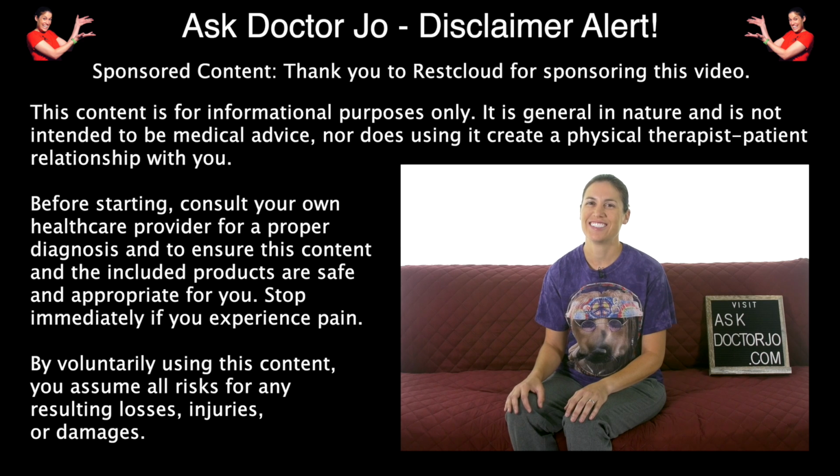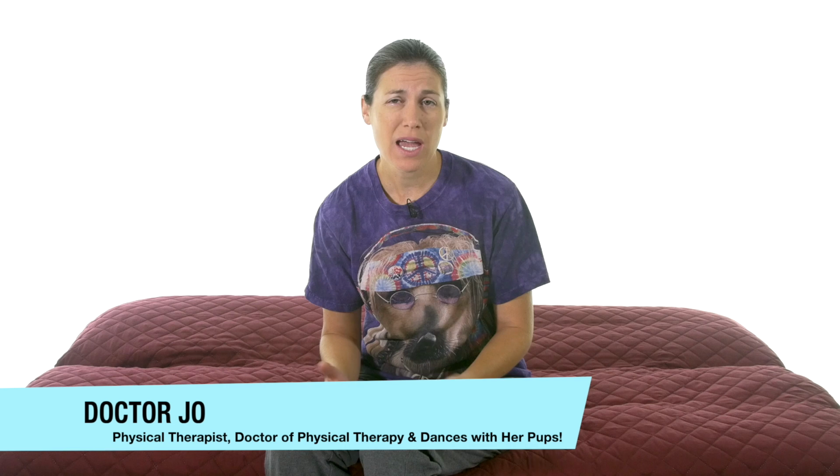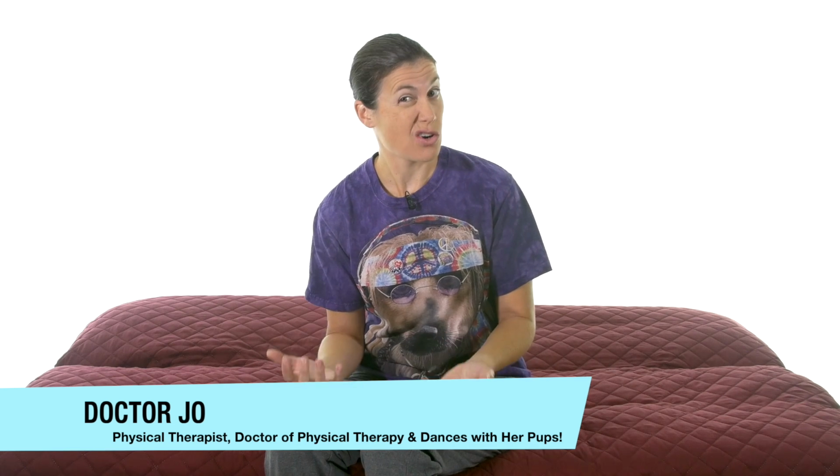So let's get started. Cervical traction can be very beneficial for things like neck pain, spondylosis, cervical arthritis, or a herniated disc, but always check in with your doctor to make sure that cervical traction is okay for you, because sometimes it might be something that you shouldn't do. But it's a great way to decompress or open up the spaces in your spine, especially in the neck area. So if you have something like a pinched nerve, or again, a herniated disc, it can really open up those spaces and take the pressure off of it.